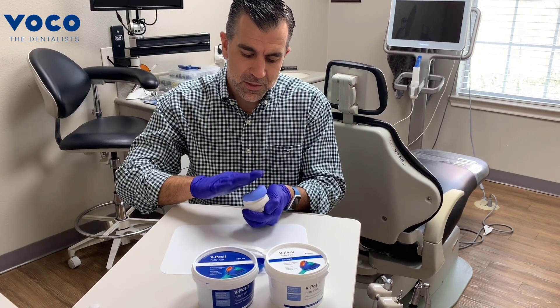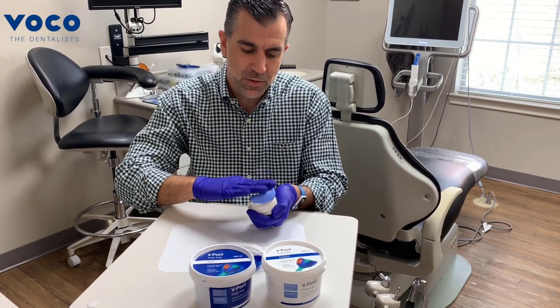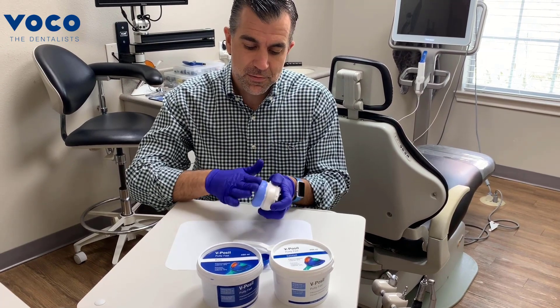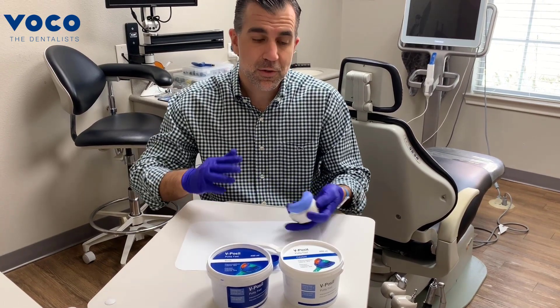This particular material takes about four minutes to set from start to finish — about two minutes of working time — and you can use this intraorally, so there's about two minutes of intraoral set time. I like to flatten out the occlusal surface. We'll go ahead and let this set for the full four minutes and then come back and trim it up.